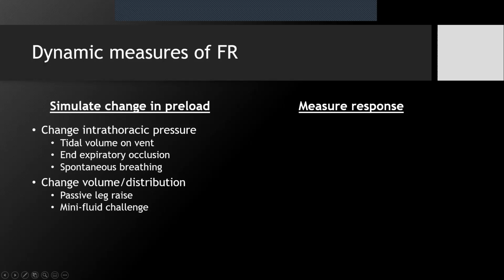There's mini fluid challenges. So you're not really simulating, you're actually giving fluid, but a small amount, which has been studied. And then there are studies that will actually do a fluid challenge, which to me defeats the whole purpose of the whole concept of predicting fluid responsiveness, if you're giving an actual 500 cc's. But you still will see studies about using fluid challenges. So these are the main methods. This cannot be comprehensive. There are others, but this is a fair overview of what's out there.